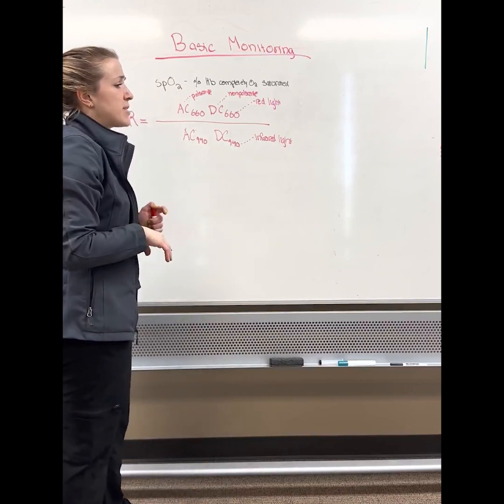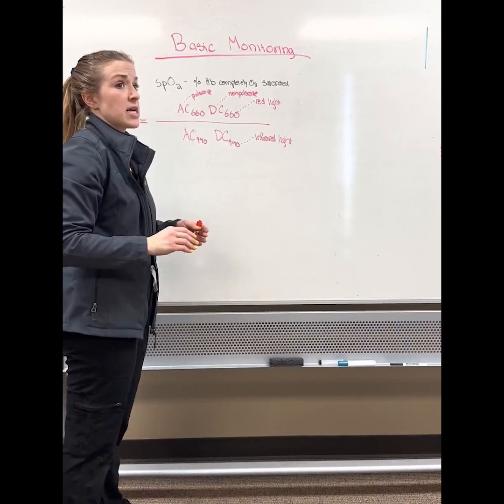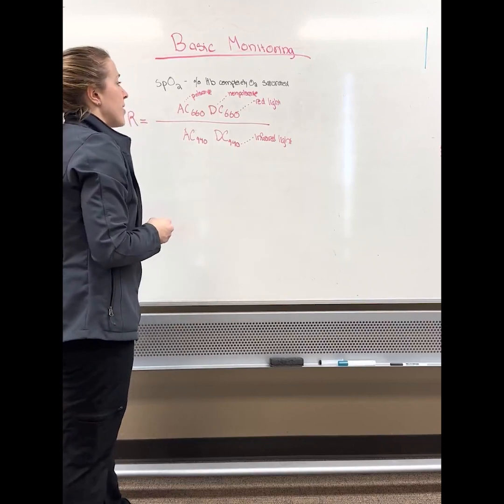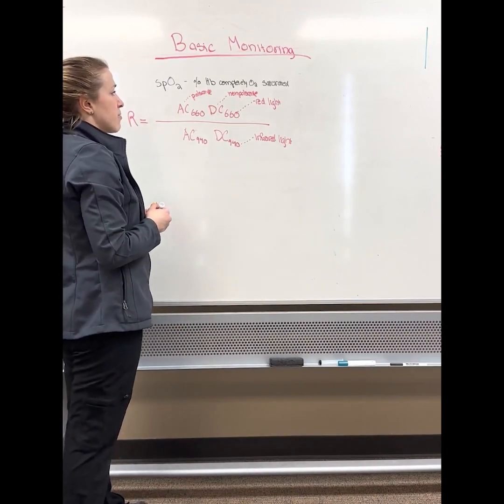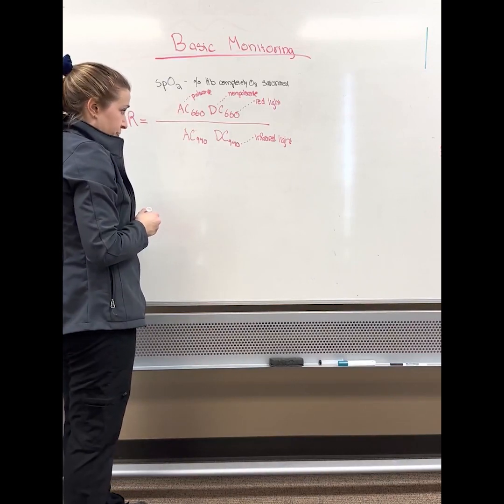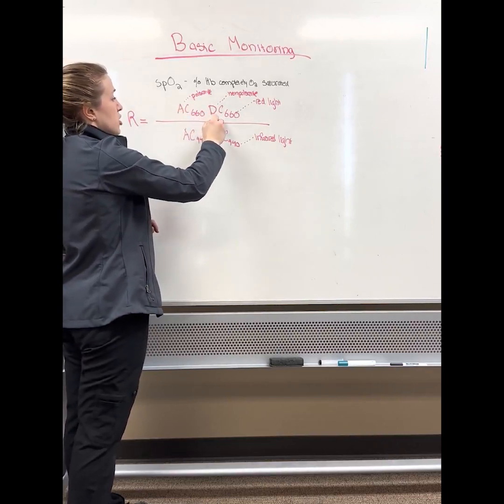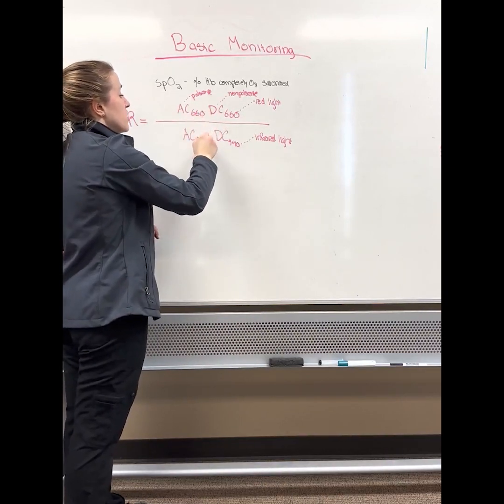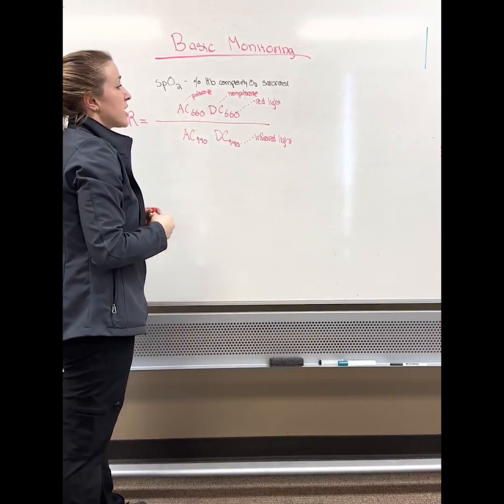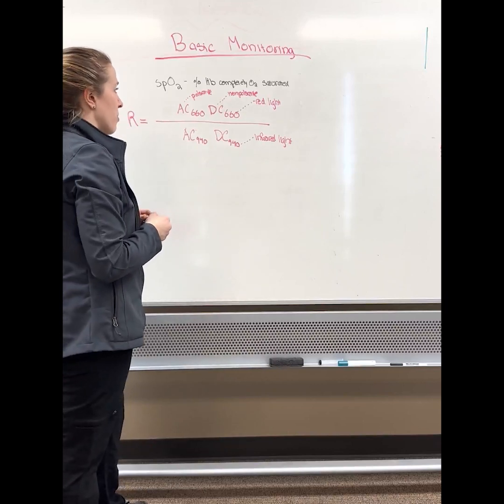So basically what happens is that when the heart contracts, the arterial bed is going to expand, in a cyclical fashion. And the oximeter is going to measure the alternating current and the direct current of the 2 different light absorbances, which are going to tell us the fraction of oxygenated and deoxygenated hemoglobin.